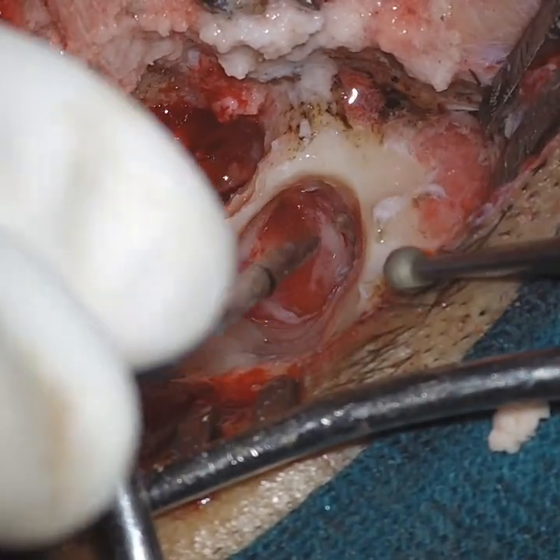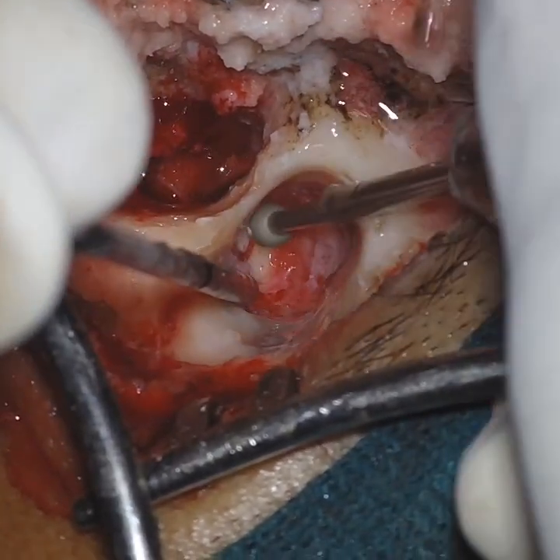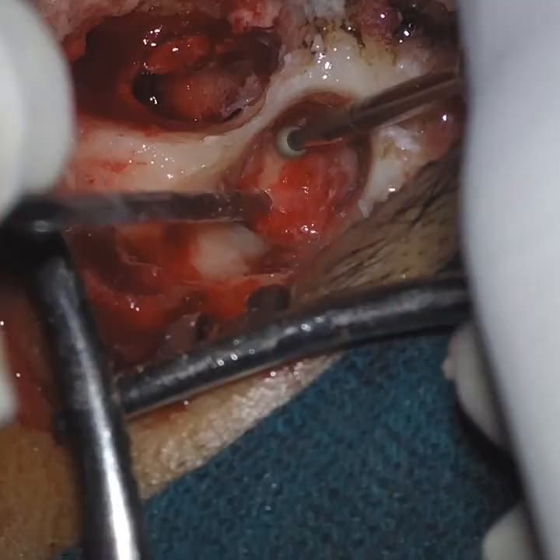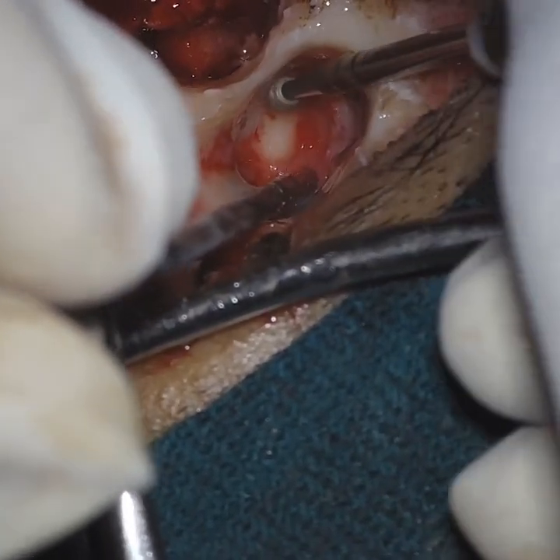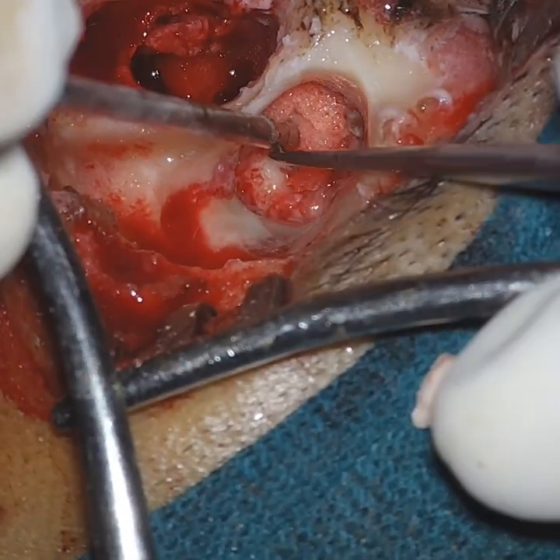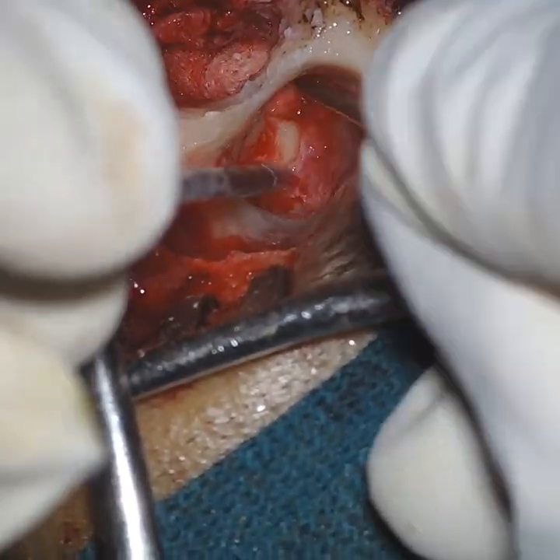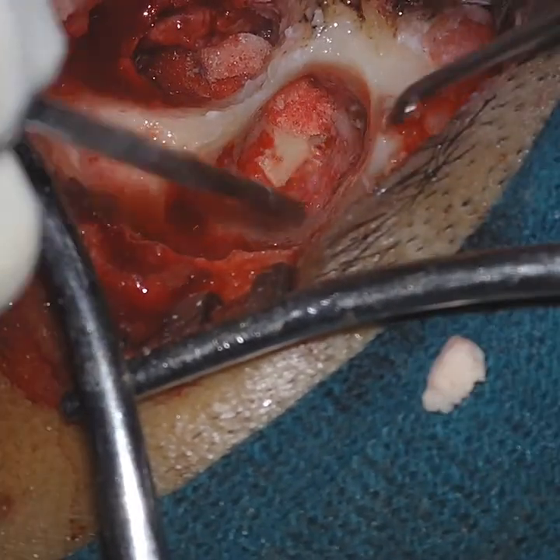So once this diseased mucosa is removed, we are almost done with the atticotomy. So once the attic is exposed and we know that there is no unhealthy mucosa in the attic, the next focus is to expose the stapes area. So here, once the attic is exposed, we are going to expose the middle ear through this route.